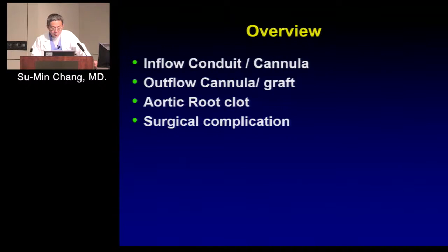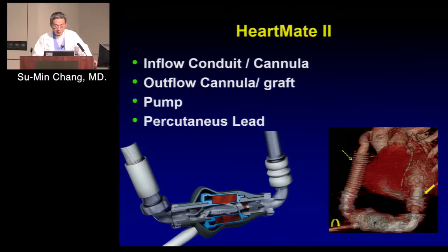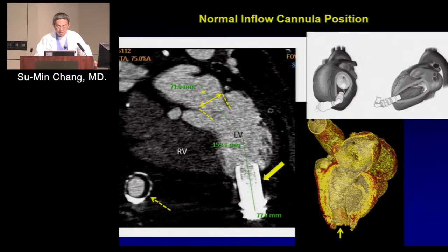Right? Okay. So in this overview we're going to go through the different components of the CT, which the main strength is anatomical evaluation. Okay. So HeartMate 2, this is the one that we're going to encounter the most. Jerry went through the different parts with you guys. So this will be a reasonable inflow cannula position. When you read the CT, the inflow cannula tip pointed toward the mitral annulus. So this will be a good position.